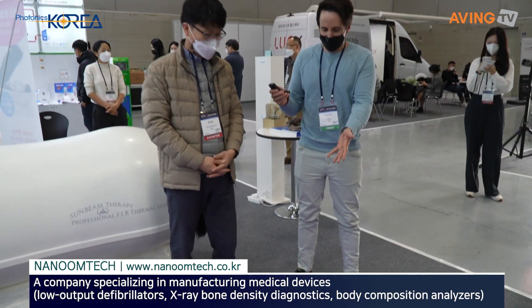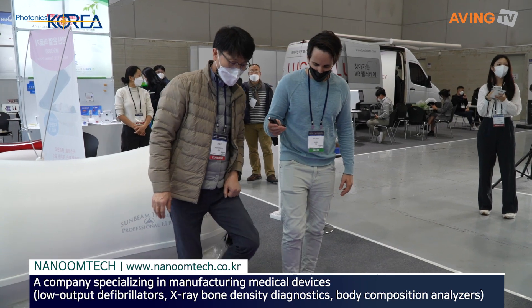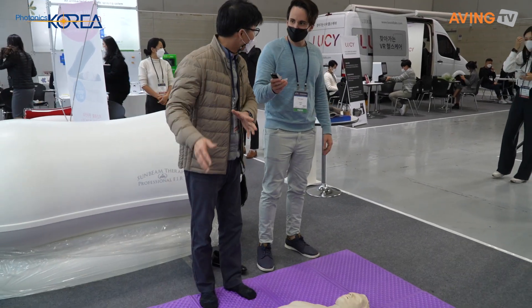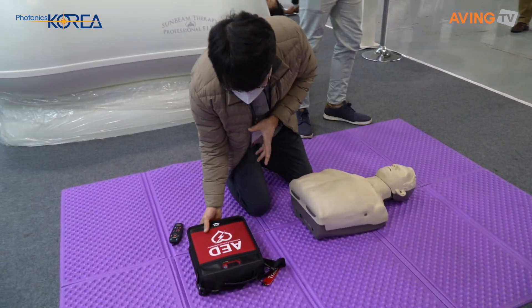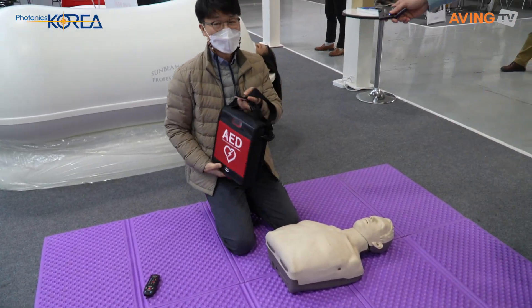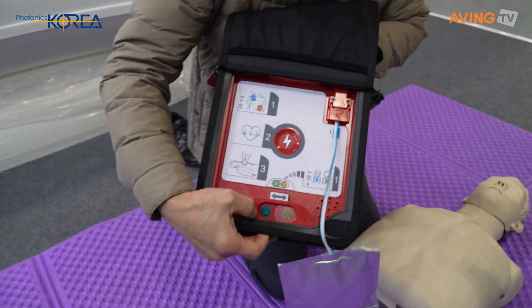Can you give us a demonstration? No problem, I'll show you. So, this is an emergency medical device. I'll show you how to use our product. Open the cover of this product, and you can find the power button.